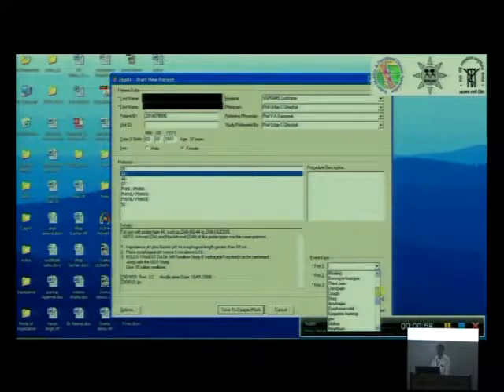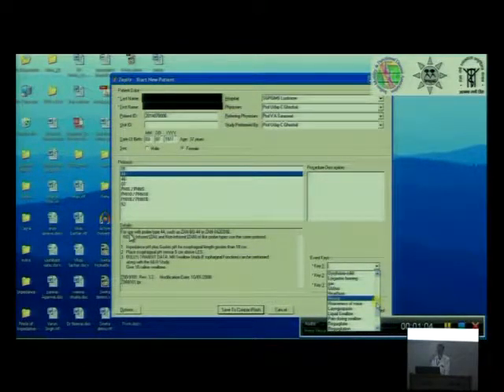So start a new protocol of the patient. Put the patient name. We have actually hidden the name for the sake of ethical issues. Give the patient ID number. Typically in SGPGI we give CR number or AR number. Then you choose the protocol. Like here it says 44. 44 means you have a chip, and for that this is 44. This is just what the company has instructed.